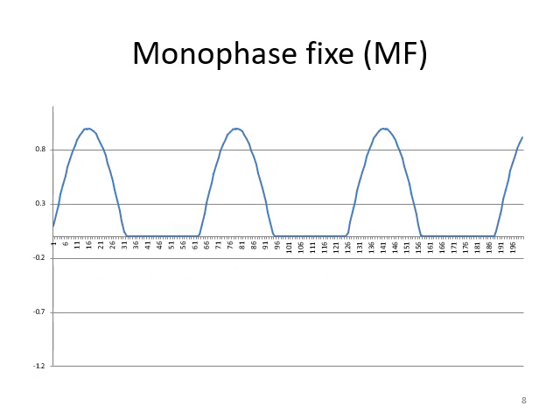Monophase fixe is one variant of a diadynamic current. In short, it is known as MF, and you can see in the image that it is appearing as only one-sided alternating current in the sinusoidal waveform. So the opposite side waveforms are nullified because it is a half-wave rectified current, and here we are able to see 10 millisecond pulses or fixed duration pulses of this alternating current.